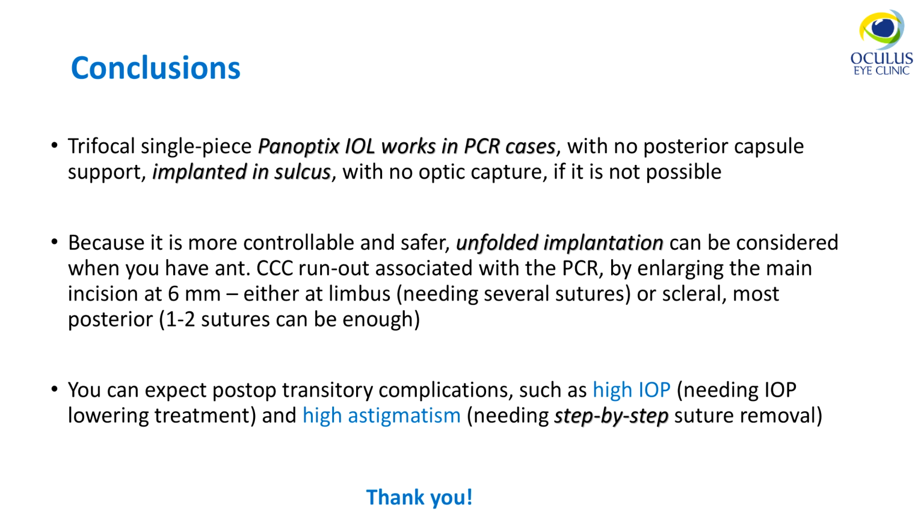You can expect post-op transitory complications such as high IOP needing treatment and high astigmatism needing step-by-step suture removal.